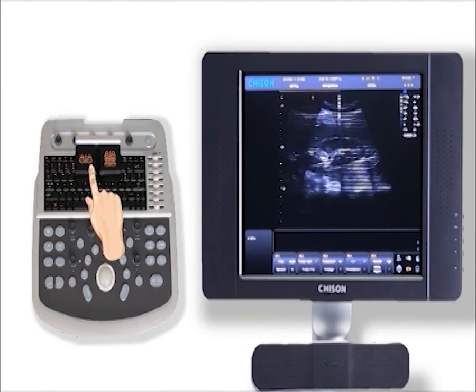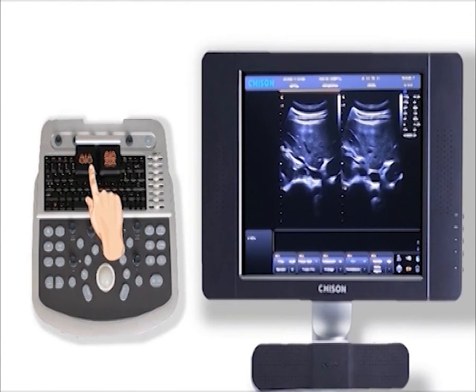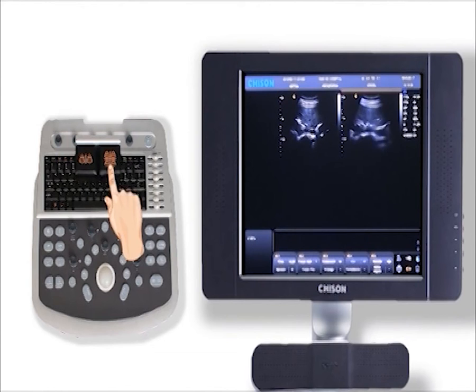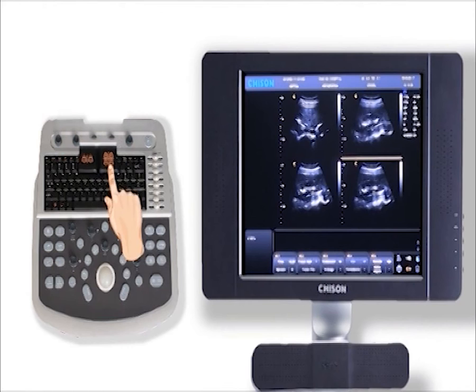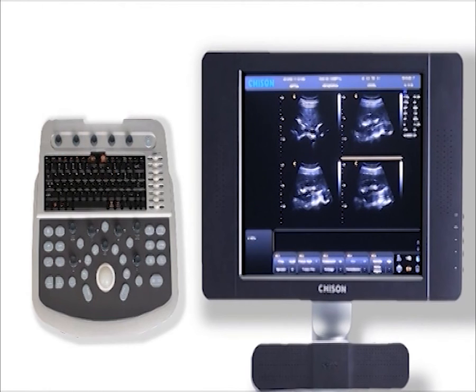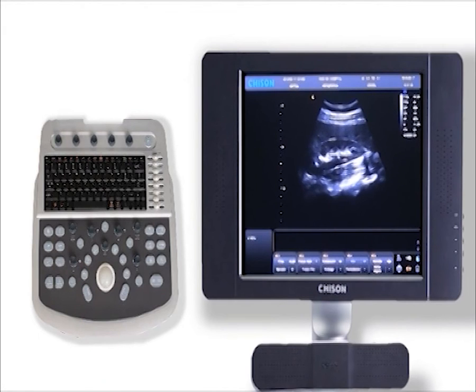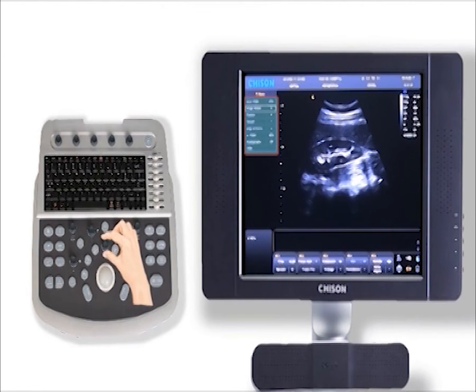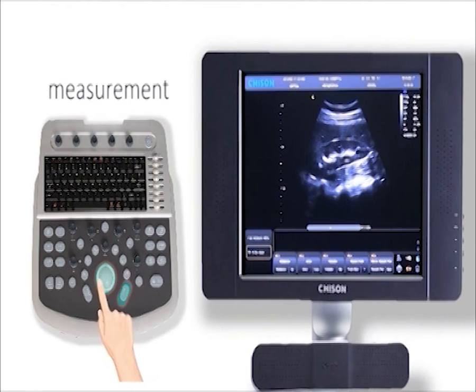If you need 2B mode, press this key twice. And if you need 4B mode, just press this key four times. We also have some other parameters accessible by pressing the menu button. This area is for measurement. Press this button to do distance measurement using the trackball and enter key.